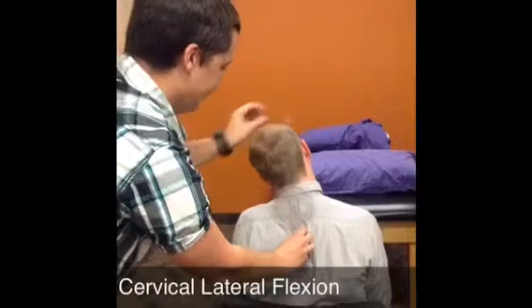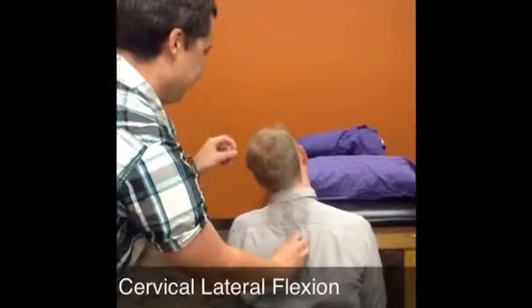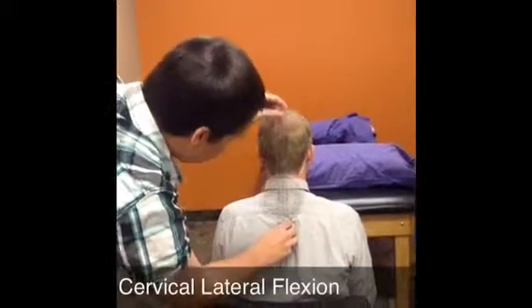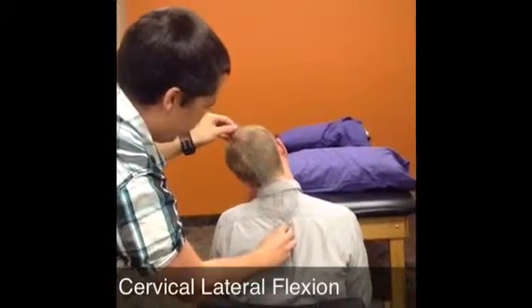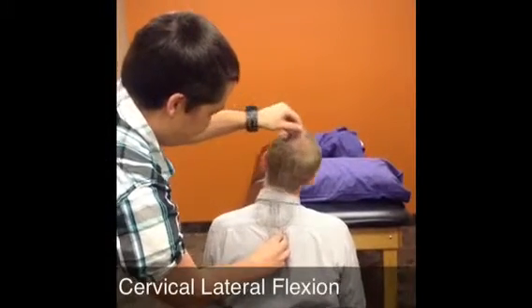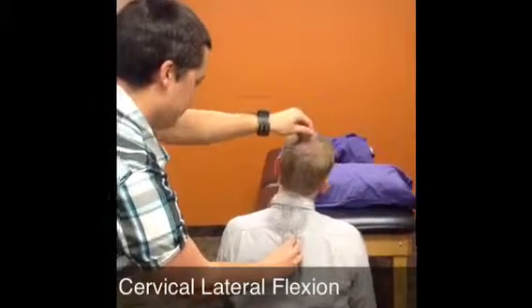So for cervical lateral flexion, the axis of the goniometer is over the C7 spinous process. The stationary arm is along the spine perpendicular to the floor, and the movable arm points towards the midpoint of the head. In the start position, the goniometer will read 0 degrees.